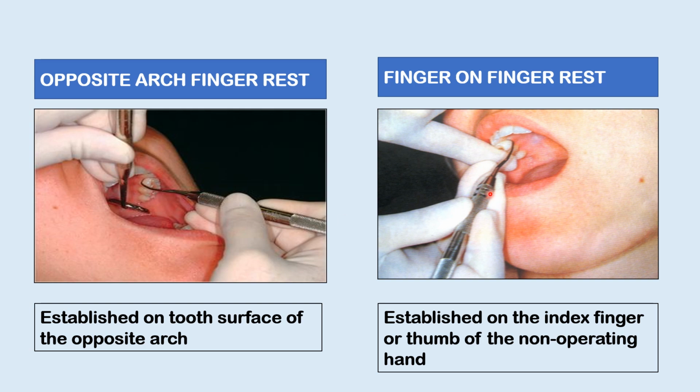The fourth one is finger on finger rest. In this, the rest is established on the index finger or the thumb of the non-operating hand.